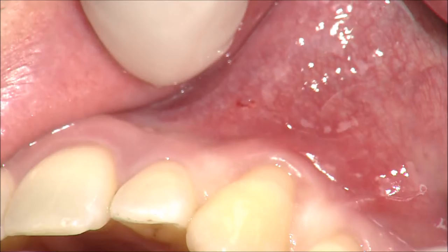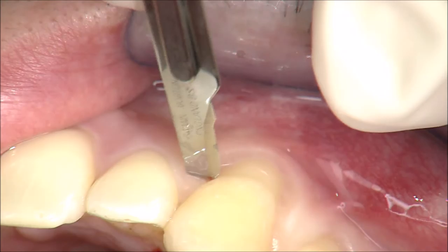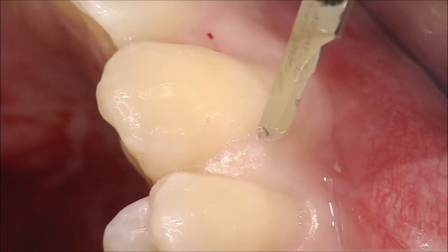We are 1 mm coronally to the CEJ, perpendicular to the surface. It's very important to keep the distance to the lateral at least 1 mm. Same on the contralateral side — 1 mm coronally to the CEJ.